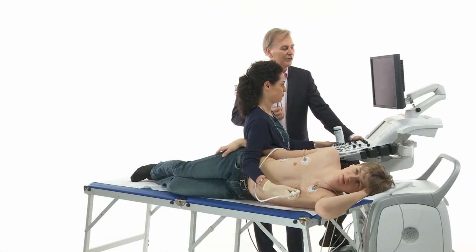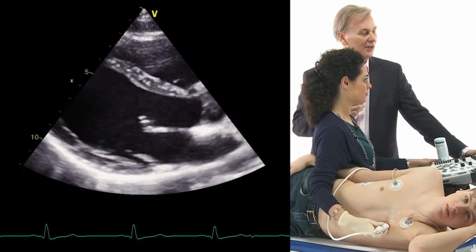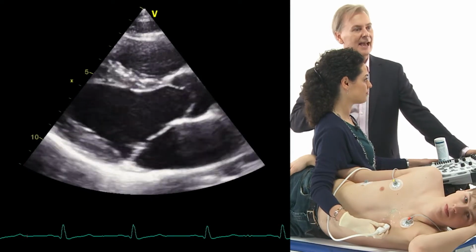I think this is so important to understand because it's a cut plane technique, and to understand we have to get a spatial representation in our head, and to do that we have to scan through the entire valve, and sometimes you will see pathologies only in one cut plane or at the edge of, let's say, the mitral valve. So you have to image the valve like Anna is doing it by scanning back and forth. And to give you a better understanding of how the anatomy corresponds to the cut planes, we're going to show you some images now.